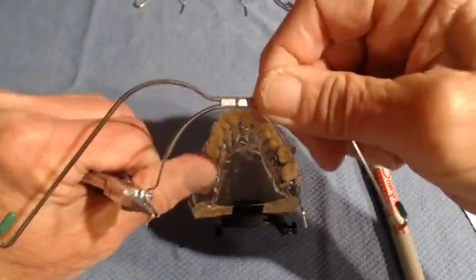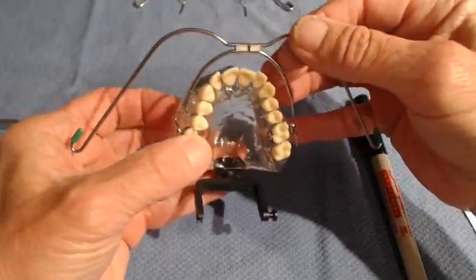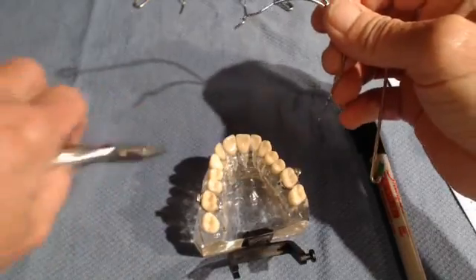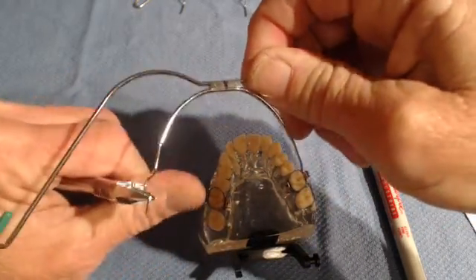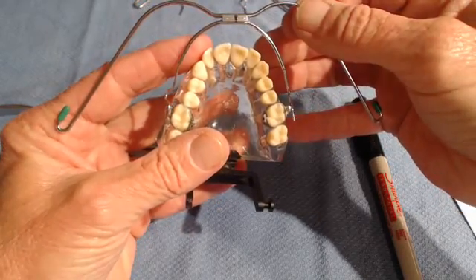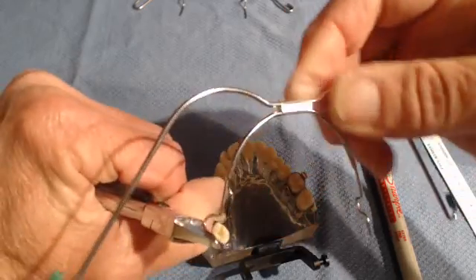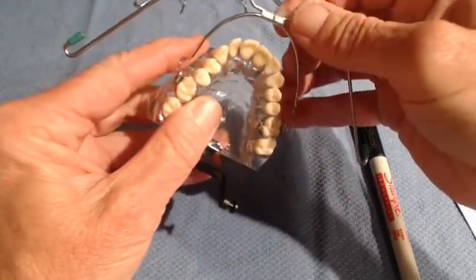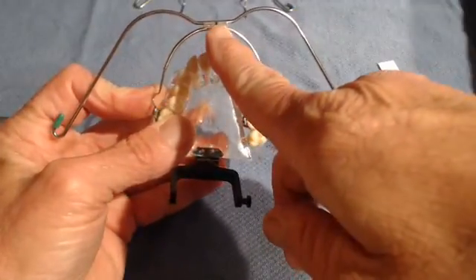That way I don't have to think about it — I can just do it quickly and efficiently. Reinsert and you can see the midline is still not quite centered, so I need to move it more to the left. Put the plier back on the mark, hold it firmly, and push it more to the left. What you're doing now is adjusting the headgear to compensate for any molar rotation in the tubes. Sometimes it takes a utility arch or a TPA to derotate the molars enough. Now you can see the middle of the arch is at the middle of the face bow.